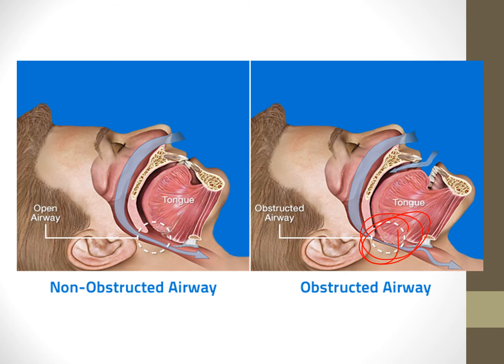So little things like that. I'm not saying to use that in every situation. You guys are going to have to work with the care team and look at each situation individually and decide what is best in that situation. So that's why I can't give you any flow chart of like start with this, start with that, right? I can give you, hey, if they're semi-conscious, nasal trumpet. If they're fully unconscious, oral airway, right? But you got to use your discretion here. You got to look at each situation, and that's where you become practitioners.